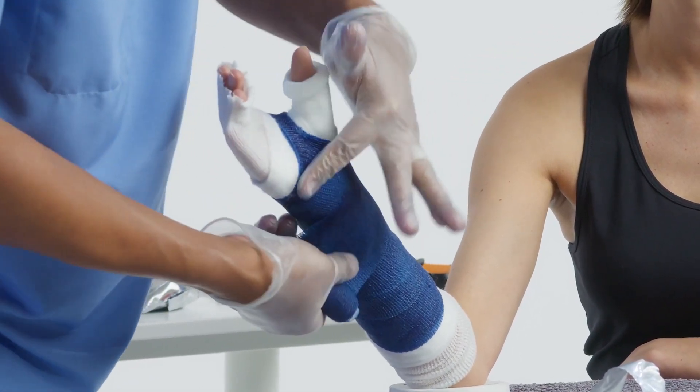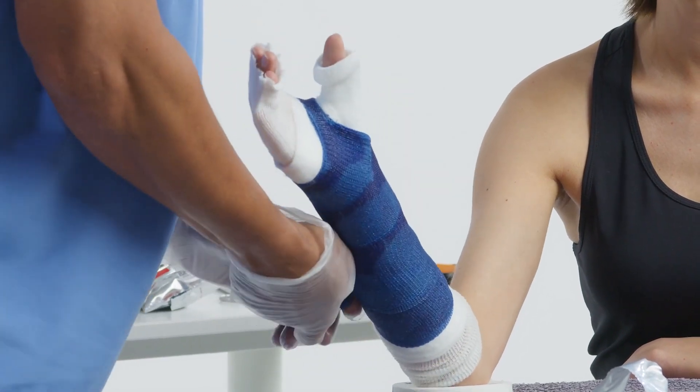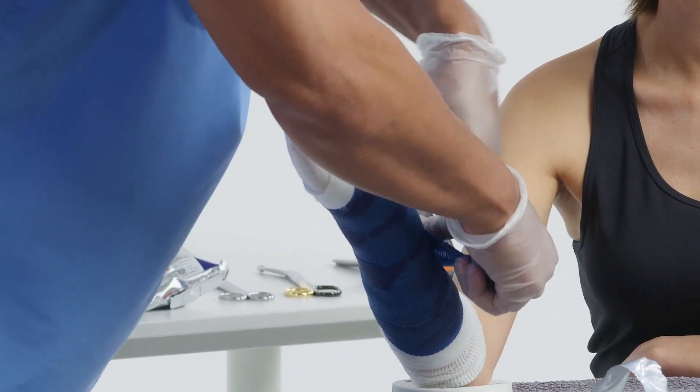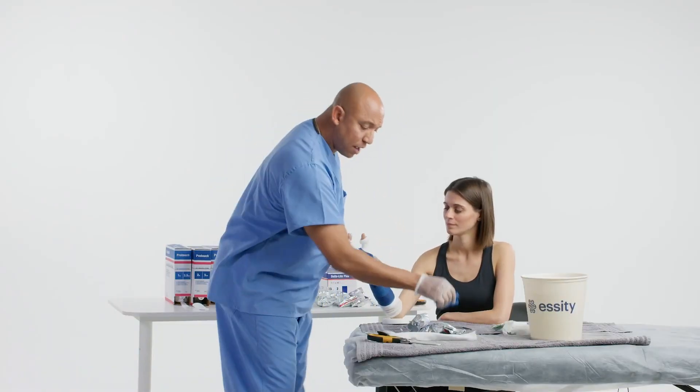As you can see in the palmar area, I got it angled — and that's important for range of motion of the extremity itself. So I cut that off. Now let's laminate it. We don't want to laminate this way; we want to laminate up and down.